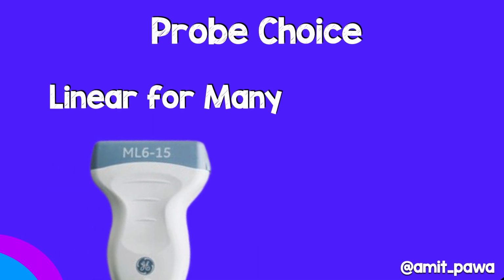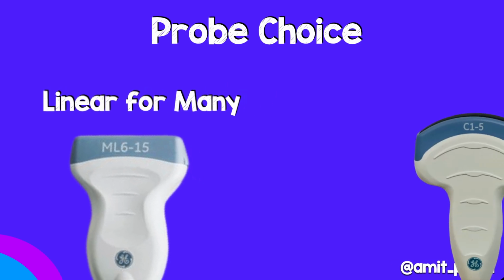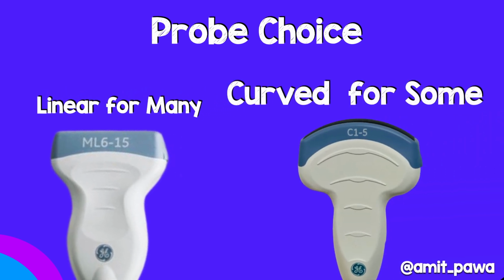Next thing we need to talk about is the probe choice. And for many people, a linear probe is going to be just fine, because from skin down to transverse process, you're talking about 3.5 centimeters, and that's sufficient. But for some patients, you may need to use a curved array probe, and the bottom line is don't be scared to use it, because suddenly it makes your job much easier, gives you a wider field of view, you get a better view of deeper structures, and you can make sure you appreciate that endpoint much clearer.